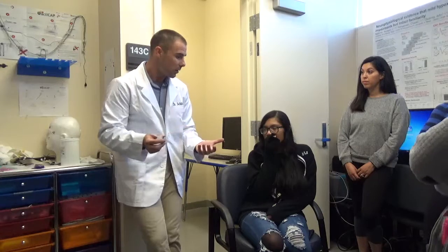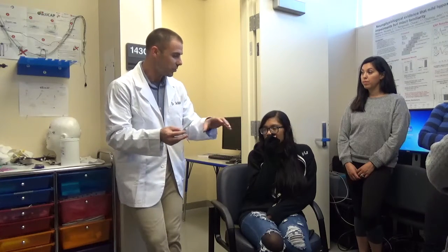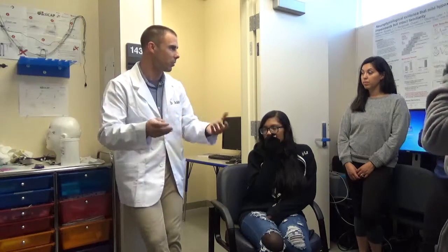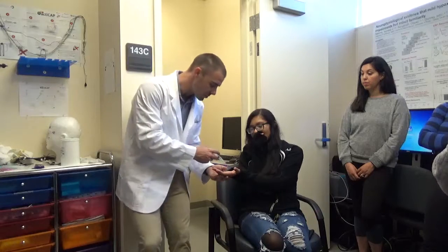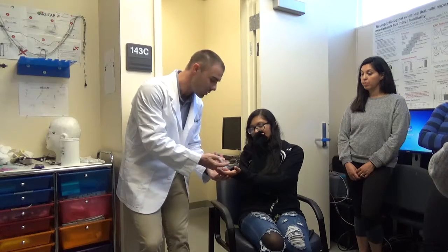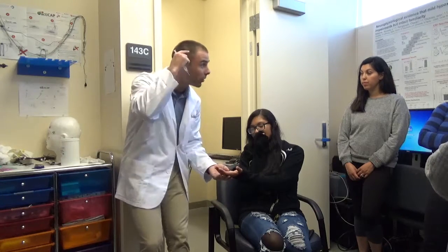Okay? So what's going to happen on the scalp is we don't just need to get the gel there, but we need to actually get through this little top layer of dead skin cells that are on everybody's skin, everywhere, all over. So basically you can think of it as exfoliating the skin. So can I borrow your hand for a moment? What's going to happen is it'll just kind of feel like this. We're going to put a little bit of this goopy gel there. So you want them to feel that, and know that it's going to be a little slimy because it'll be a little cold on their head.